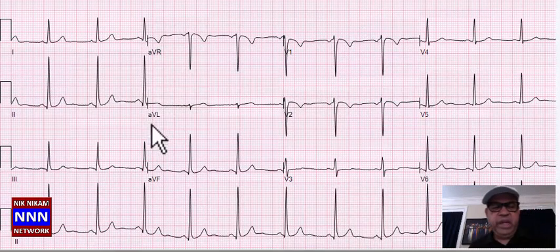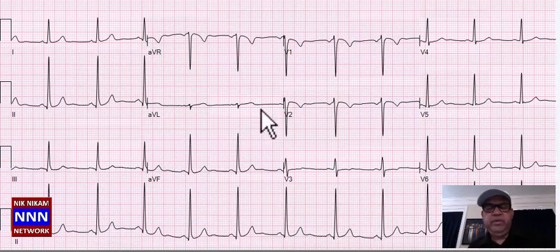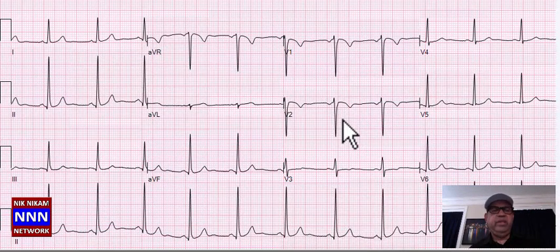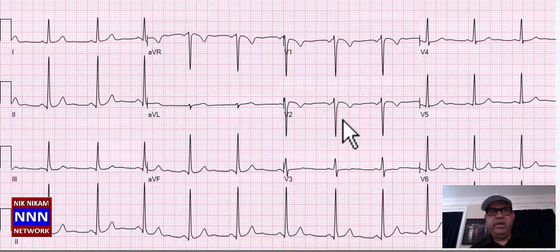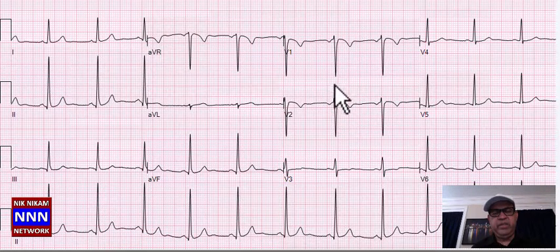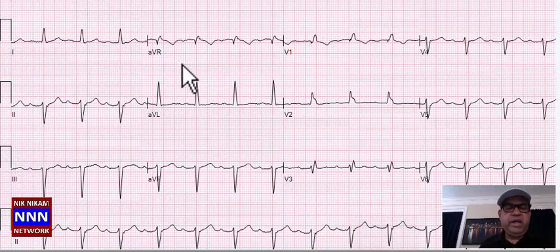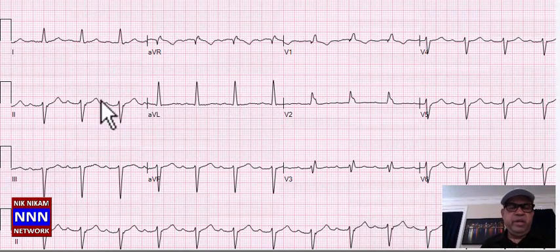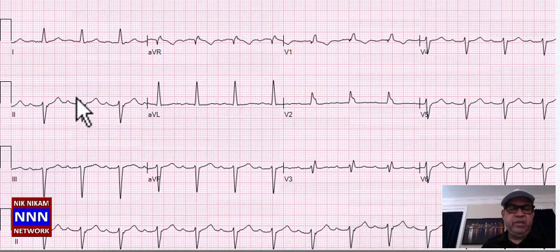Again we have sinus rhythm with T-wave inversions in the anterior leads, but since this is a 34-year-old female, this may be normal findings. Nothing really significant to suggest anything pathological.